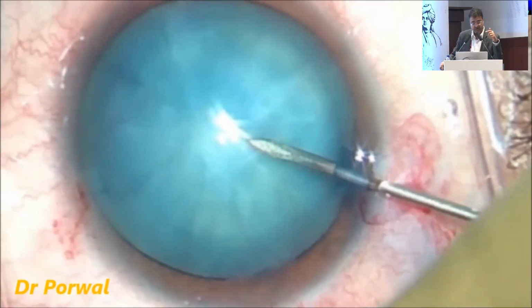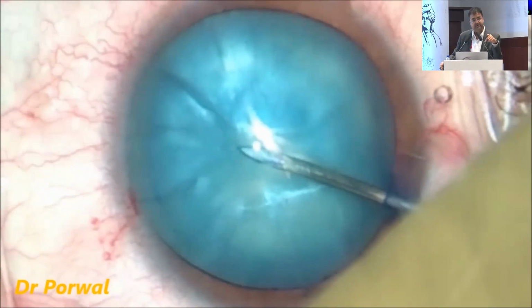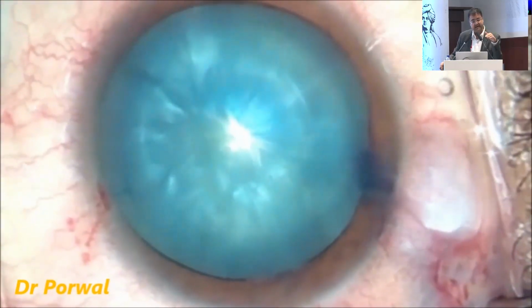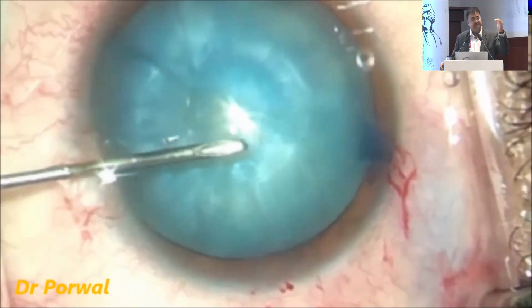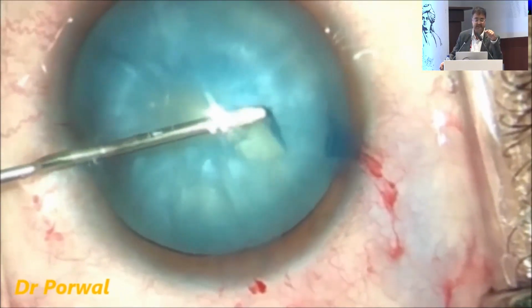you get better control. See, once again I'm showing another video. I pierced inside, I'm aspirating. You saw the concavity which has appeared? So this is important. The central concavity is there, and in this concavity there's a mid-peripheral bump. So when you start with your rhexis, you should know how the tear has extended in the center.